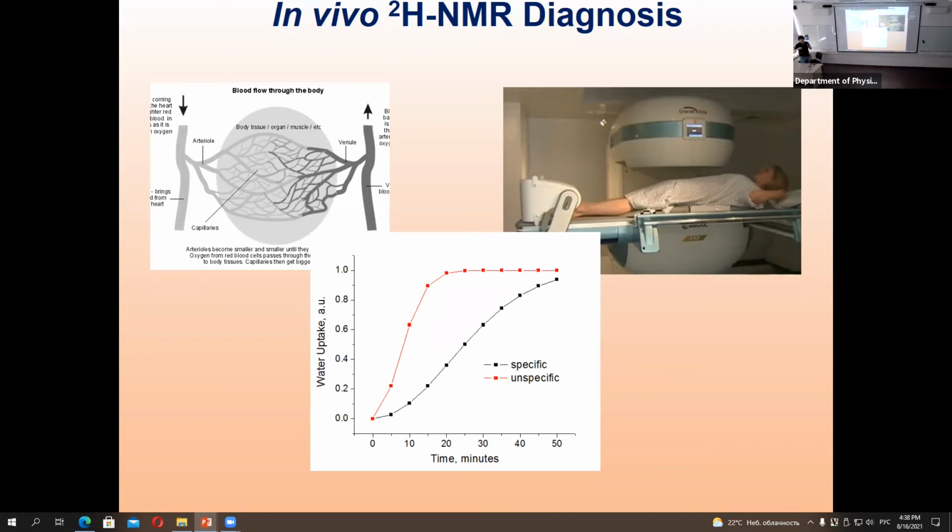The lady is lying, and there are two coils on two breasts, and we are measuring the signal of deuterium. She takes a very small amount of heavy water with a low concentration, and in 5 or 10 minutes we get a rise of the signal, which is going much faster in the tissues corrupted by cancer. Really interesting project. Unfortunately, it stopped because it needed more money. Nonetheless, it's interesting, so I can talk a lot and answer your questions.